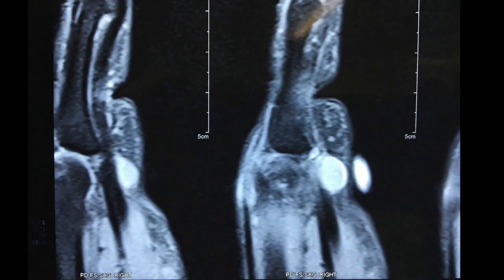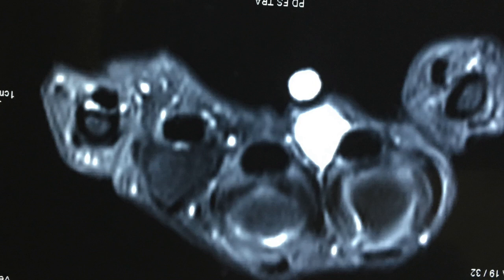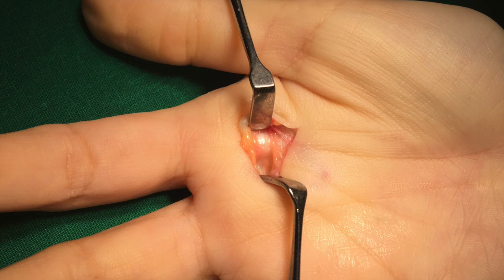This patient presented with a trigger associated with a ganglion cyst over the A1 pulley. This can be diagnosed with a thorough clinical examination and further investigations like an MRI, like in this case, or a well-performed ultrasound study. Here, the ganglion was excised and the A1 pulley was released.